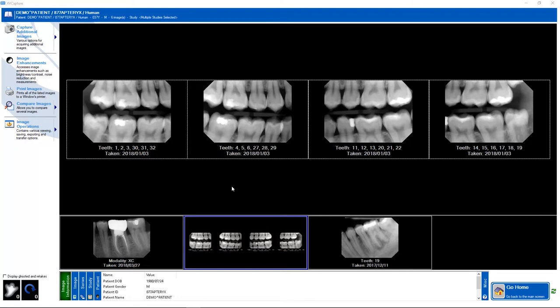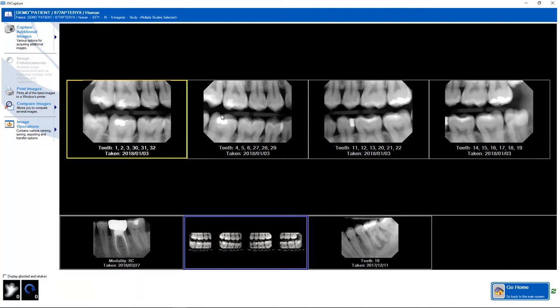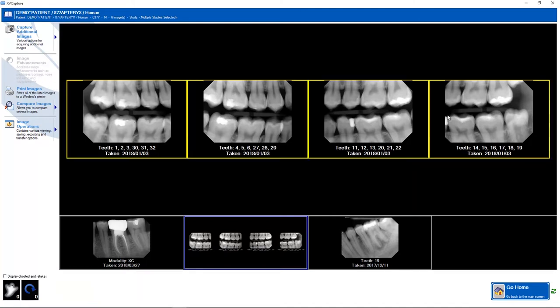From the image collection screen, you would select the images that you specifically want to export. For this ByteWing series, if I want to export the entire series, I would select all four images. If I were to not select any images, it would automatically export all of the images in my image collection screen.